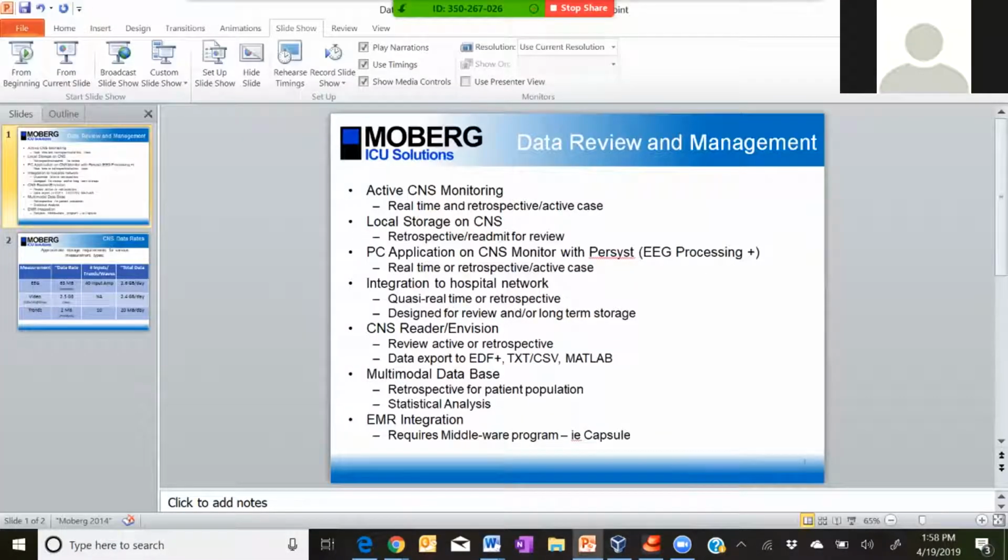So you've really given this nice overview of the options and flexibility of how to choose to retrieve, keep, access, review, research, extract all of the data that we get from the CNS monitor. And really the abundance of information we get is a blessing because we can always go back to those files later and slice and dice them many different ways.